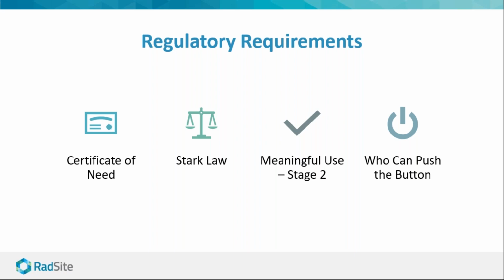In most states, or actually in all states, you can be a physician and you can push the button, or of course you can be a licensed radiologic technician. We don't recommend in this case to hire a licensed RT by and large, unless you're a very big practice and you have maybe over 10 locations and as many CT scanners. You could probably get away with having the physicians push the button. But again, we train all of the staff to safely operate the scanner, so you can position the patient and the physician is only present for the actual scan itself, which in most cases is less than 20 seconds.